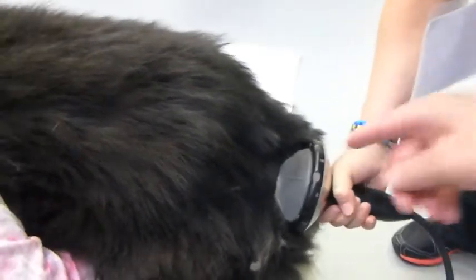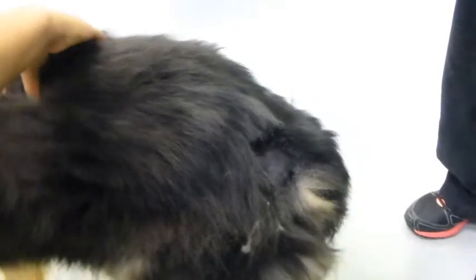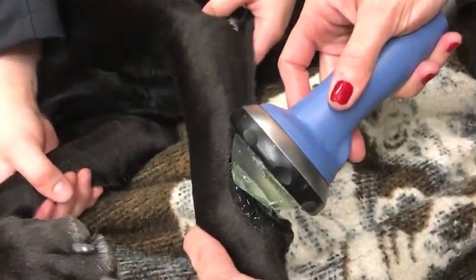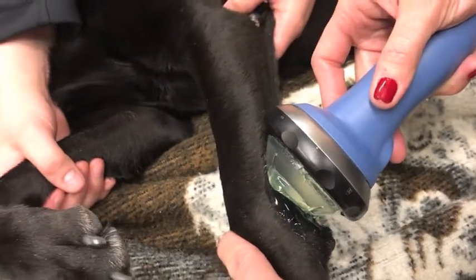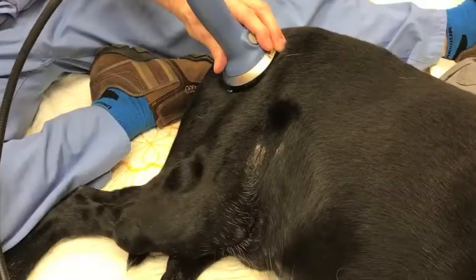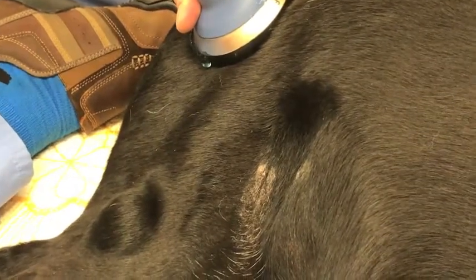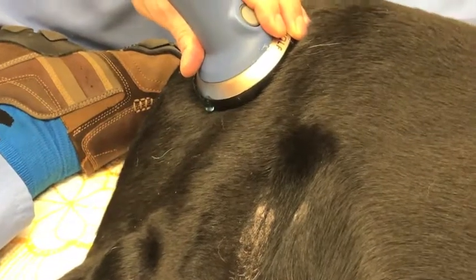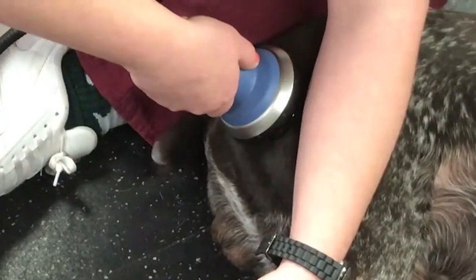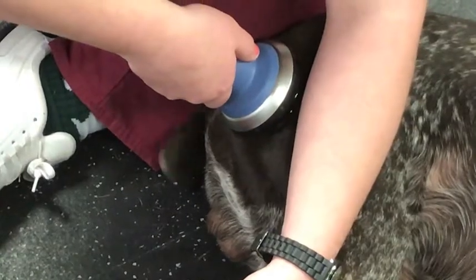Now you might want to just kind of move it around up and down a little bit, maybe get a lot more gel on there, and just see if we can find another spot. Usually with hips... I think you would do 800 with him because he's so sensitive. Yeah, that's a pretty good clue. That's it.